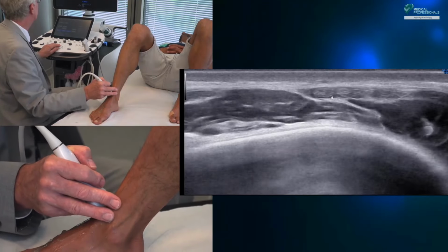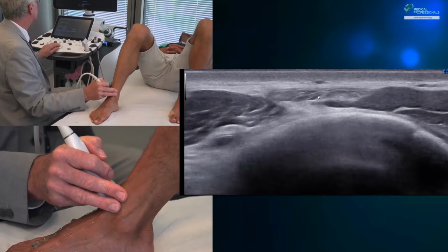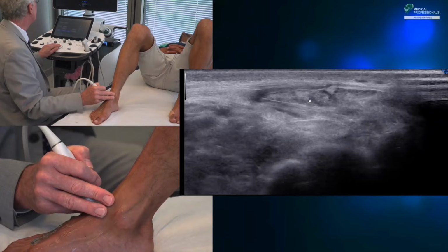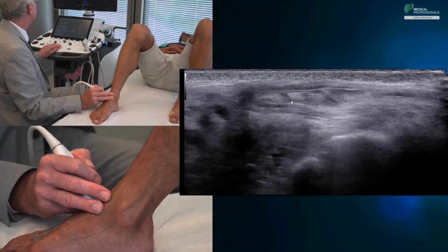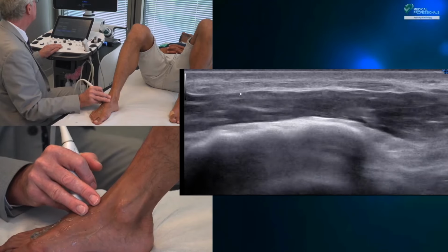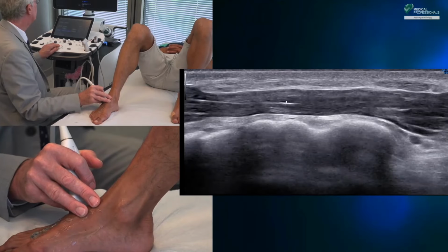Back to the tendons. We follow them distally. Here we see the neurovascular bundle with the deep fibular nerve. And here we have the extensor digitorum longus. Watch as this extensor digitorum tendon splits into several branches that become very superficial and line the single muscle on the dorsal side of the tarsus, which is the extensor digitorum brevis. We see these are very superficial small strips, extremely vulnerable to a blow from a crampon, for example, or other objects.